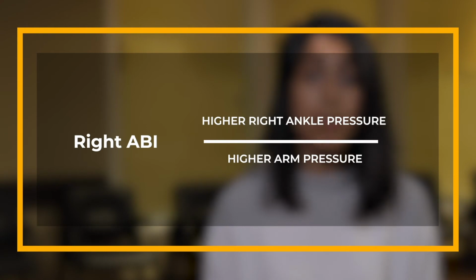To calculate the ABIs, you will require the higher values of the posterior tibial and dorsalis pedis artery pressures for each leg, as well as the highest of 2 brachial artery pressures. Divide each respective ankle pressure by the brachial pressure. For example, for our patient, he had a higher right arm pressure, right dorsalis pedis artery, and left posterior tibial artery pressure. So his calculation would be as follows.